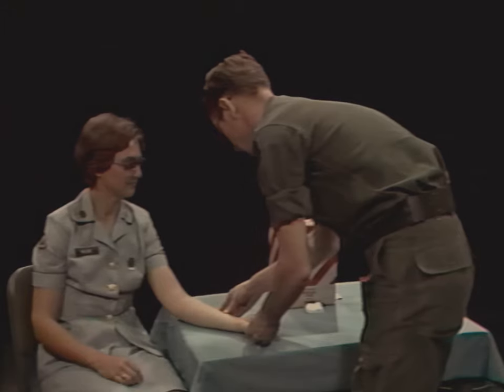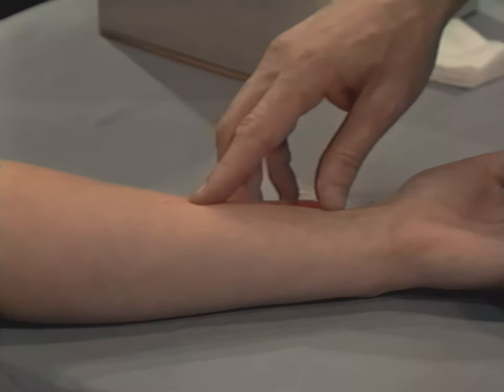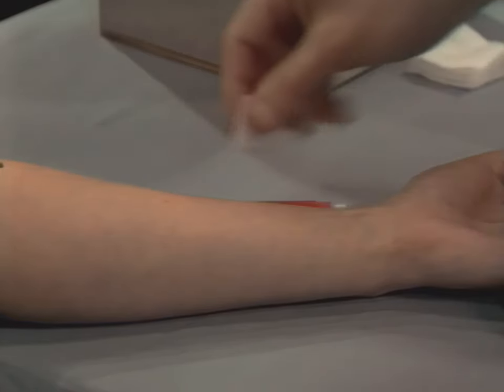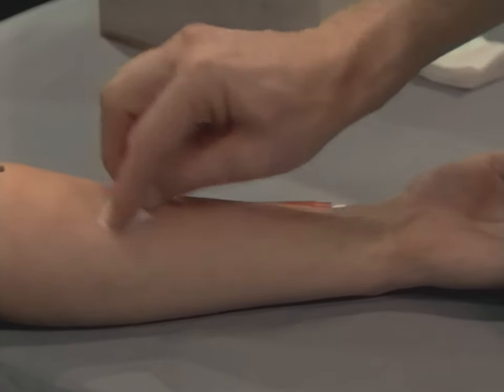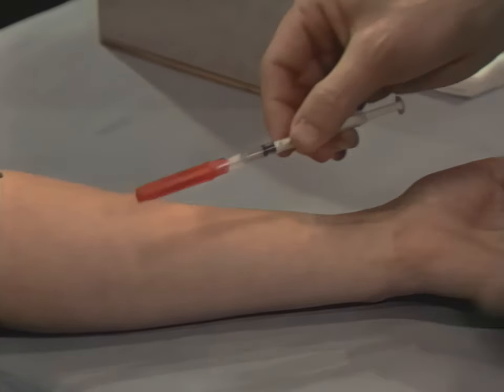For an intradermal injection, select a site on the inside of the patient's forearm — the side which would be exposed when the hand is palm up. With a sponge wet with disinfectant like ether or acetone, cleanse the injection site using a firm, gentle circular motion, cleaning outward in a spiral.